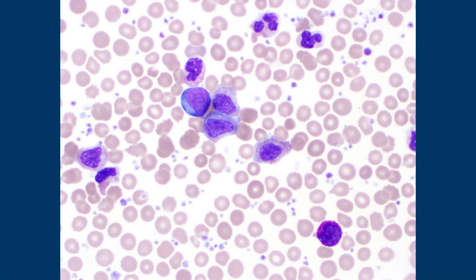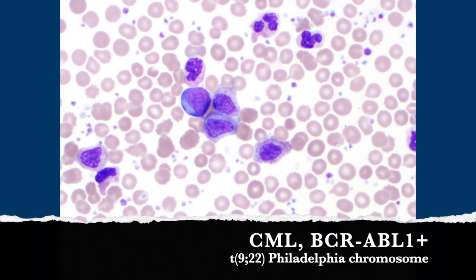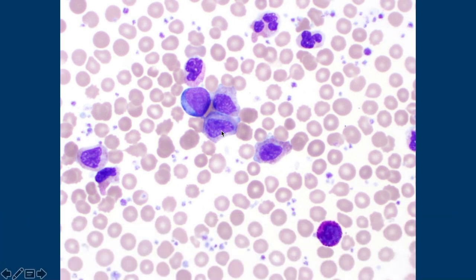You can even just get a thrombocytosis. The real way to diagnose CML is to do the 9;22 translocation test — so the BCR-ABL. And these myelocytes — can they look a little bit like monocytes? So these are young myelocytes because they've got that blue tinge.